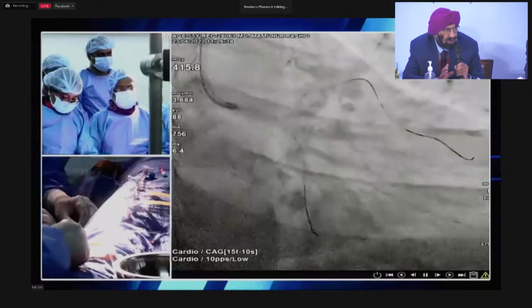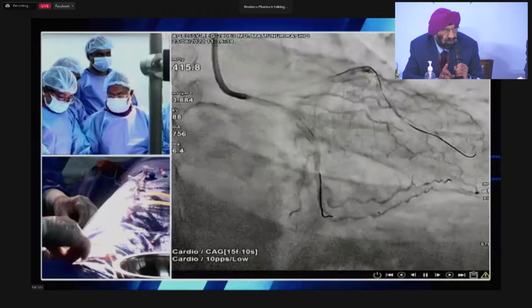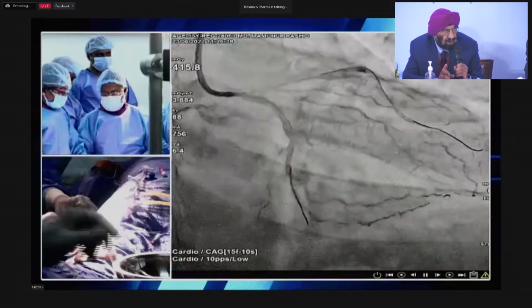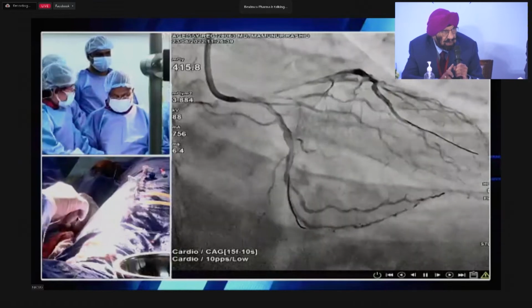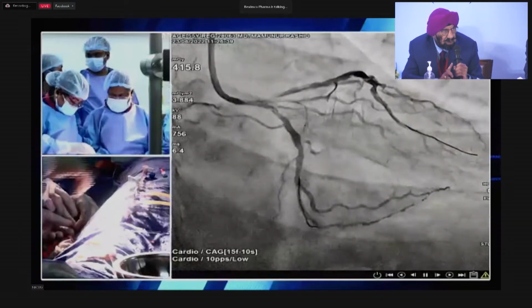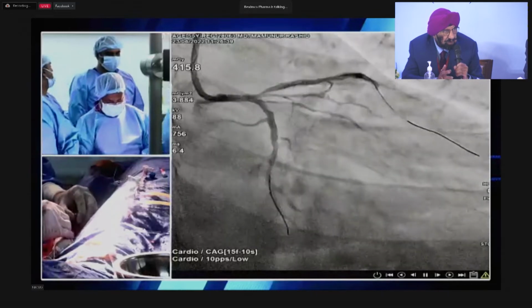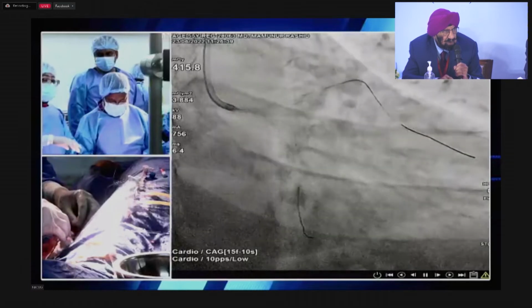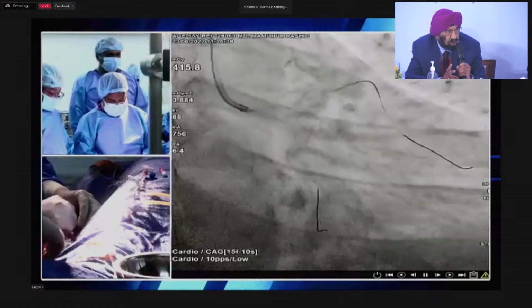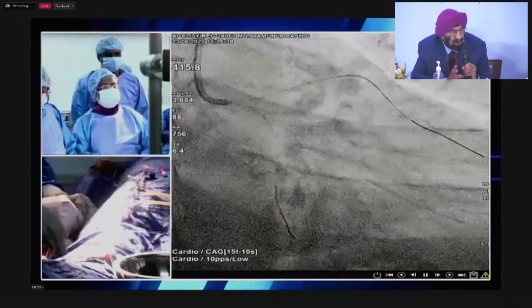So what I feel is that instead of putting one single stent, you may put a 3.5 in the distal vessel and then take a 4.0 and remaining part of the LAD and going on to the left main should be stented with a 4.0, which can be expanded up to even 5.25 or 5.7. Synergy can be expanded even up to 5.75. So I would like to use 2 stents here depending upon the total length, how much you need on the IVUS.